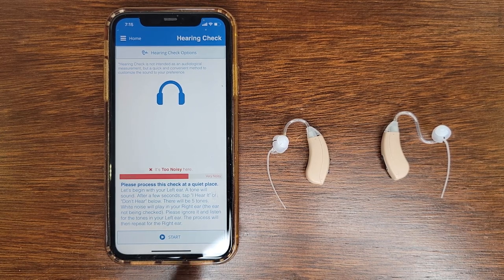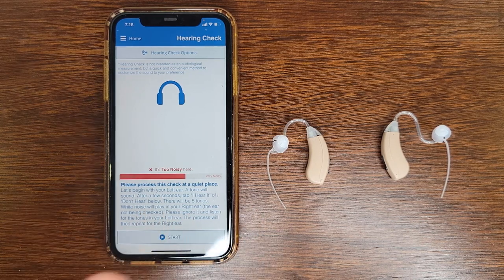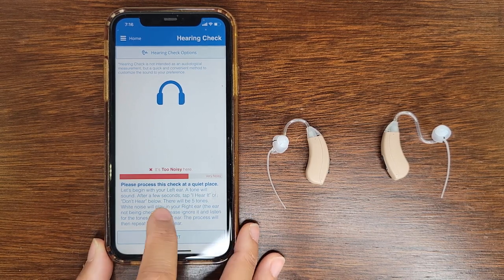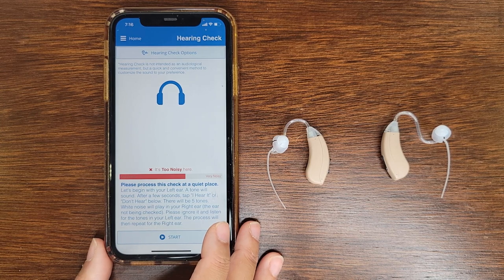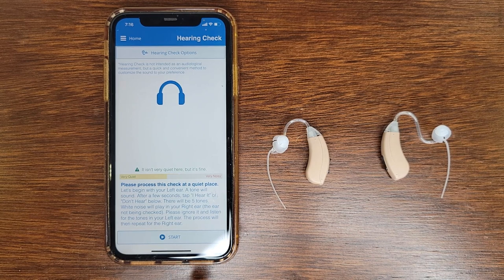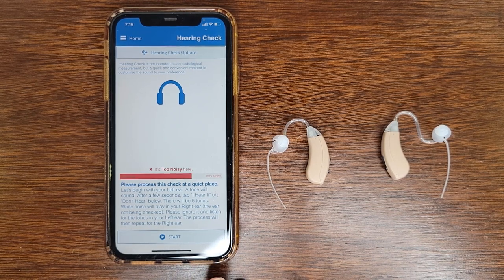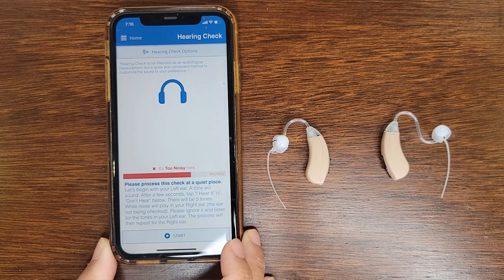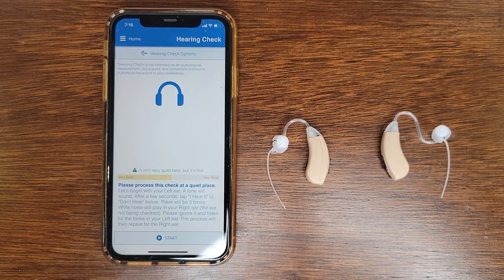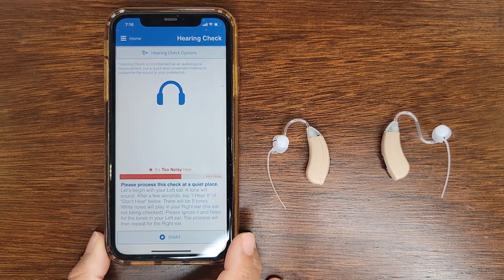So this would tell you the noise level in the room. Ideally, you would want it to be in a very quiet area, like a mid-quiet place. Just make sure you check your place and make sure it's a quiet area. I'm talking, so it's fluctuating. So let's start our test and see what results we get. This is a sample test, so your results will be different.